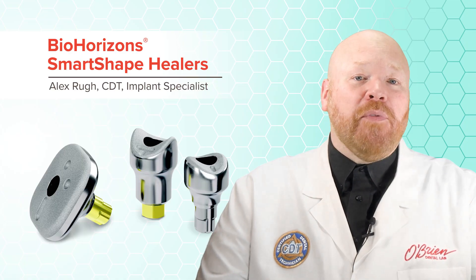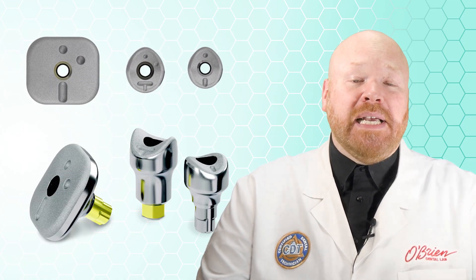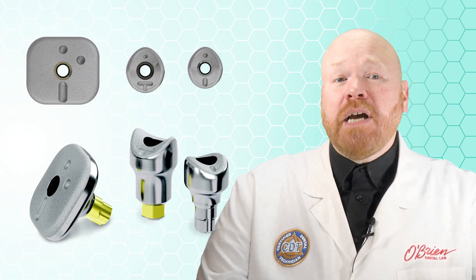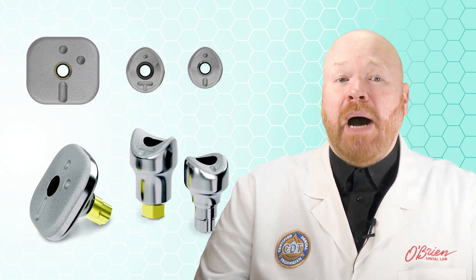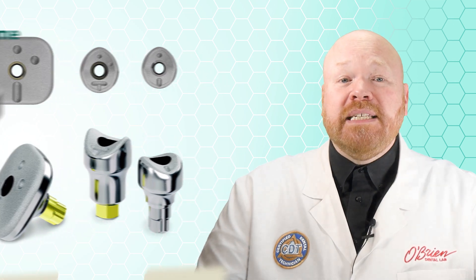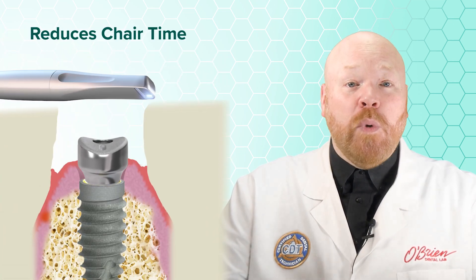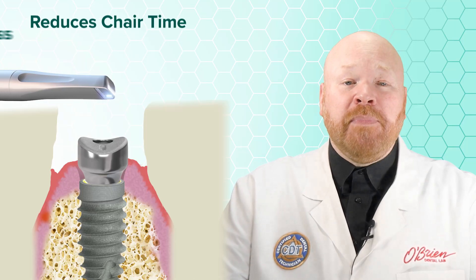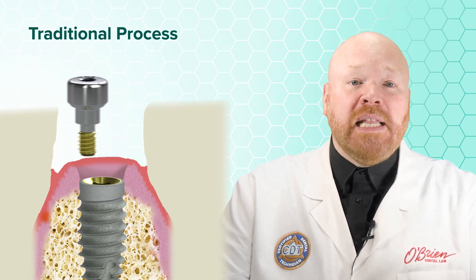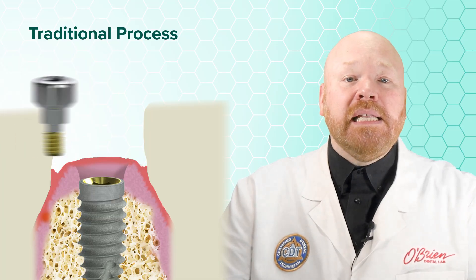The really cool thing about these is that they have occlusal markings that allow them to be used in place of a scan body. There are a couple of big advantages to combining a healing abutment and scan body into one part. First is that it reduces chair time — all you have to do is take a scan with the healing abutment in place. Traditionally, you'd have to remove the healing abutment, place the scan body, take your scan, and then replace the healing abutment.